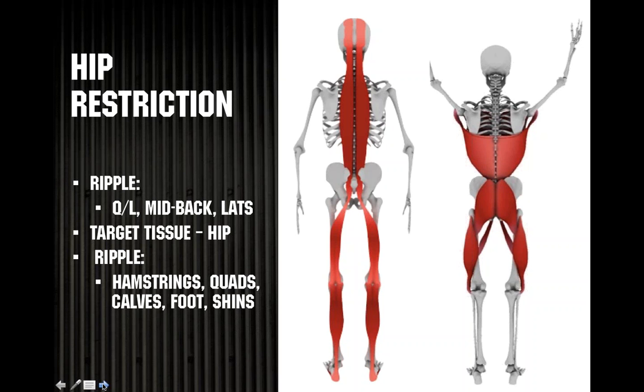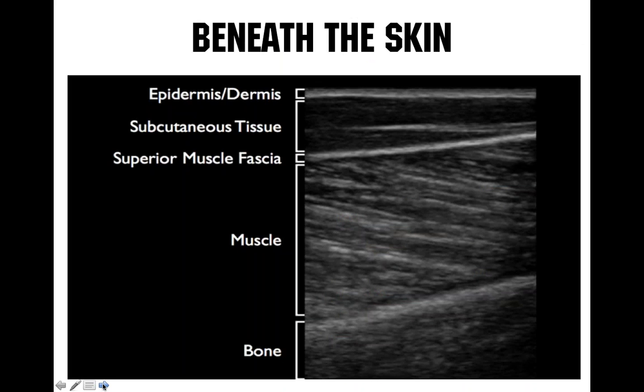Let's talk about these fascial lines and see if we could input more information, whether that's to upregulate or downregulate, to the tissues above and below along the fascial lines. Dr. Capobianco had some really good information looking at diagnostic ultrasound. He likes to play with diagnostic ultrasound a lot. And I think some of these slides really bring home what's going on underneath the skin.